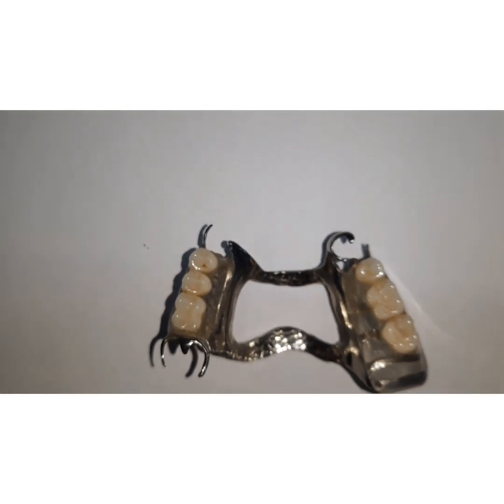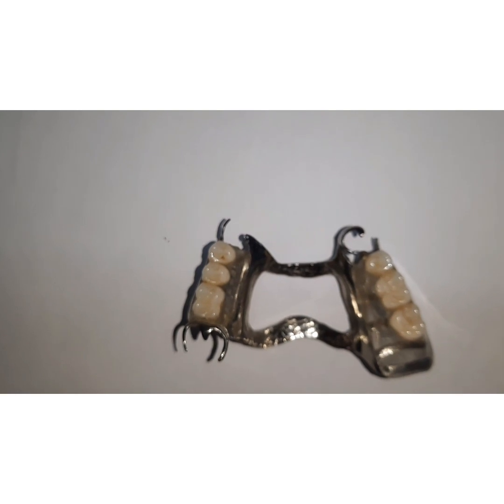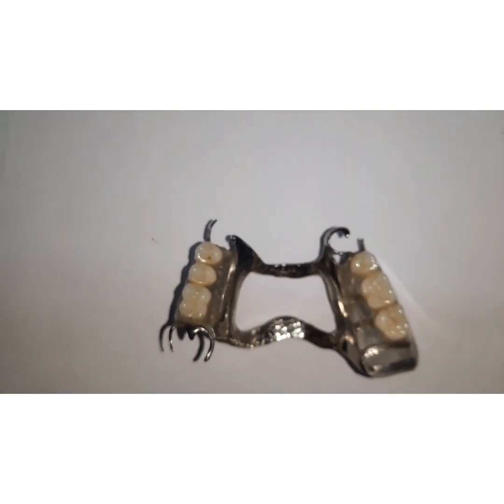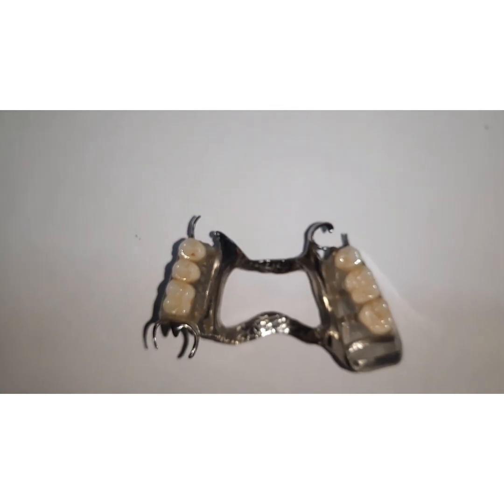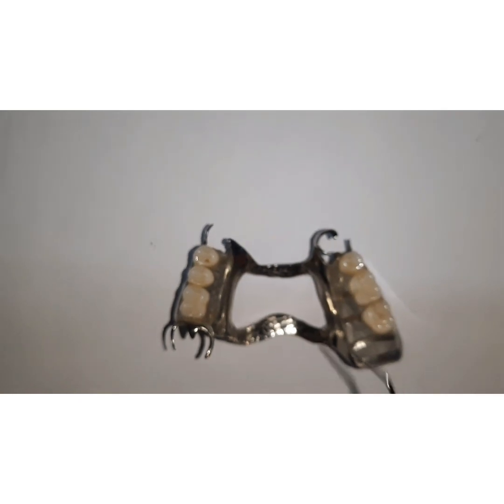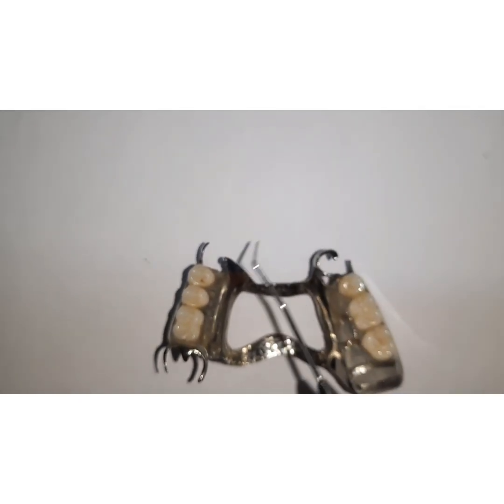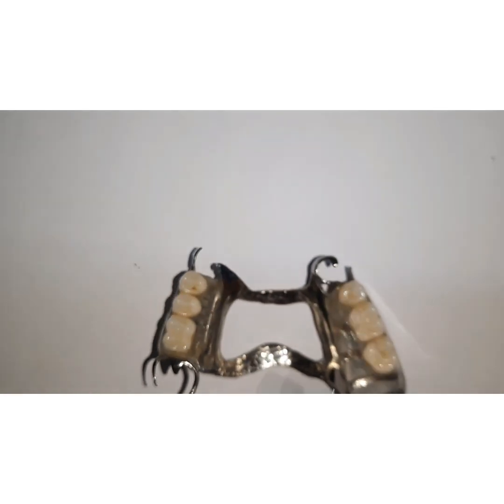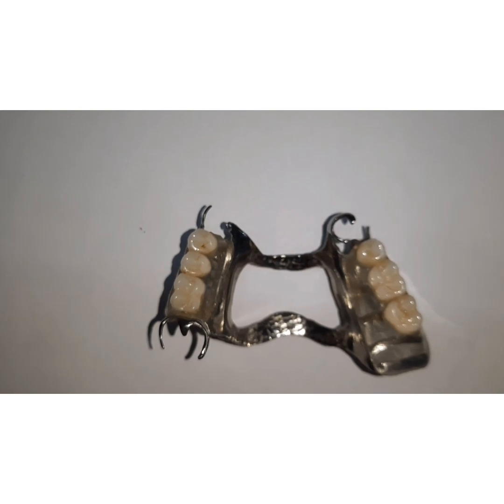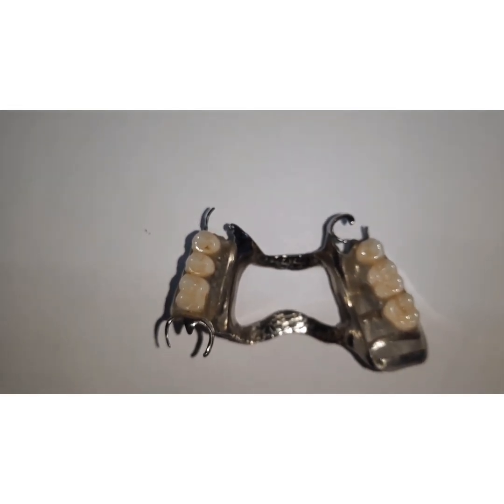Initially advise that you'll get comfortable with time, because initially it does happen with all the patients. But if the problem persists and the patient complains of not having a proper speech, then the anterior teeth need to be removed and placed in a proper position and then acrylized. Minor problems can be addressed by adjusting the contours of the prosthesis with the appropriate abrasive.